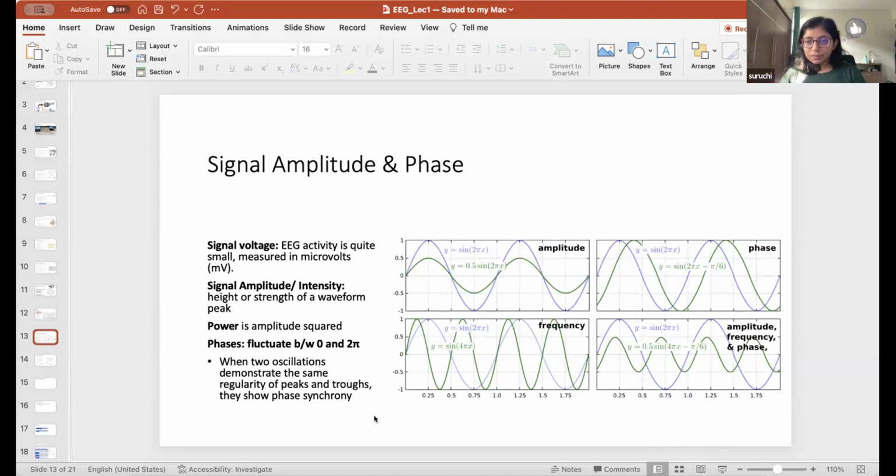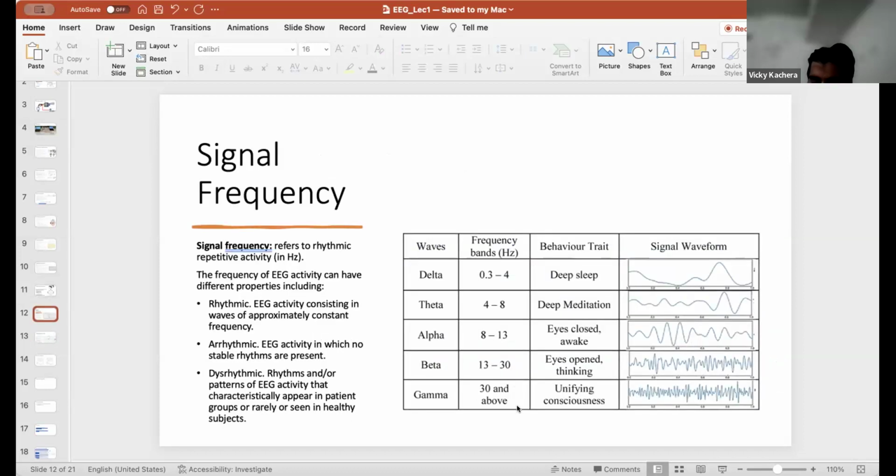Frequency, you understand, right? Yeah, ma'am, before moving on, I just want to reconfirm the concept. Initially we discussed the frequency or the sampling rate actually. So you mentioned for every second, 250 samples of measurement. In frequency of wave, it is the number of peaks in a second. So in one sample, it has the number of peaks in a second, right? That's what we are measuring in the frequency of wave.